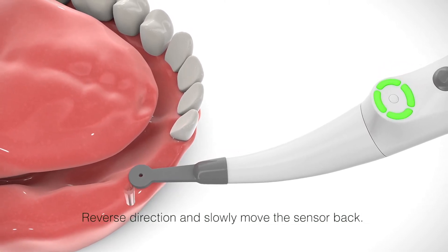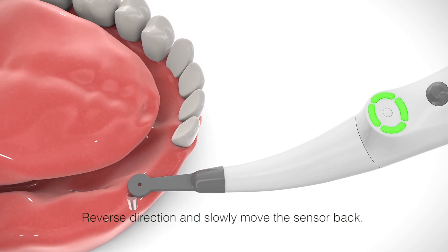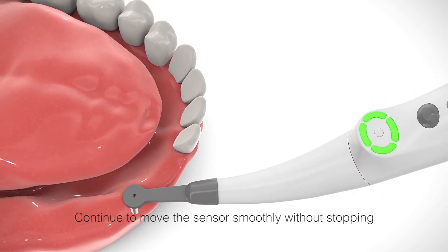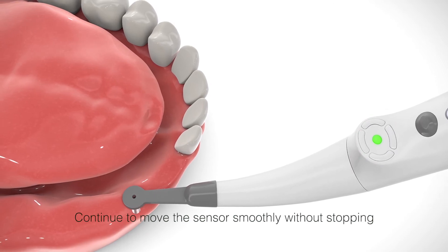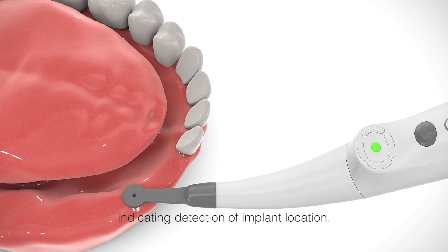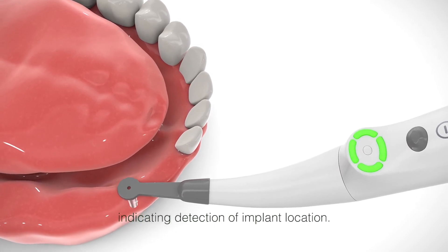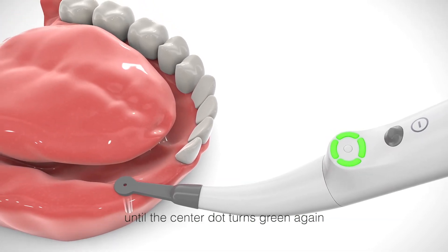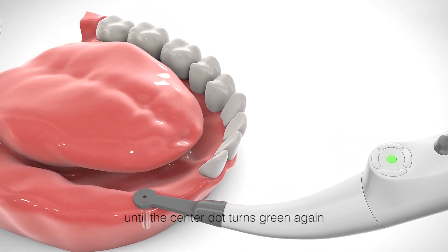Reverse direction and slowly move the sensor back. The four segments turn green again. Continue to move the sensor smoothly without stopping until the center dot turns green, indicating detection of implant location. Perform additional crossway scanning in a cross direction until the center dot turns green again.